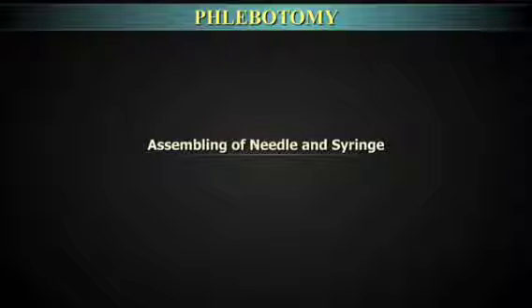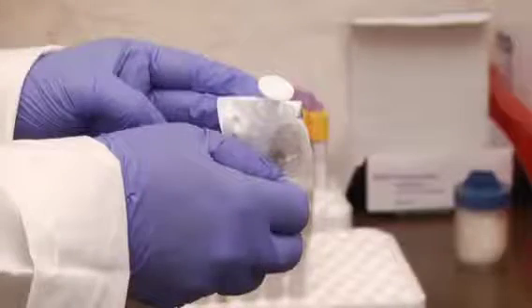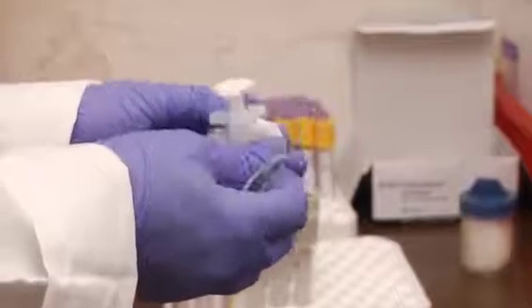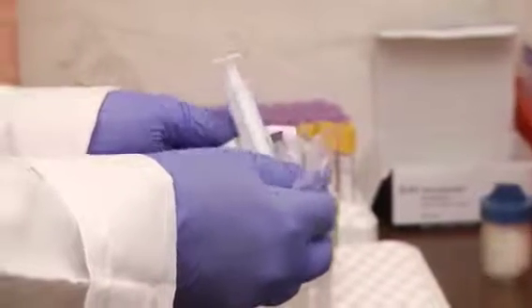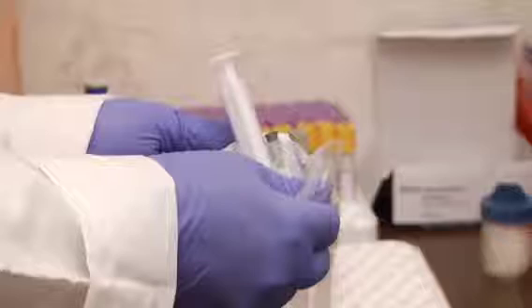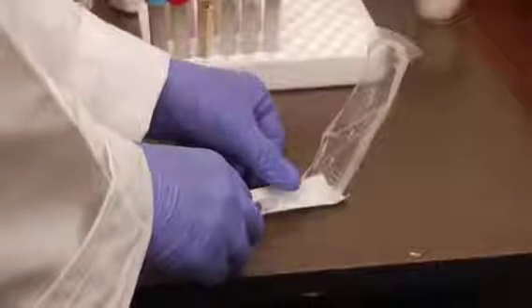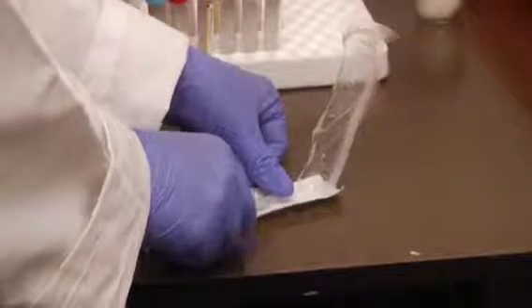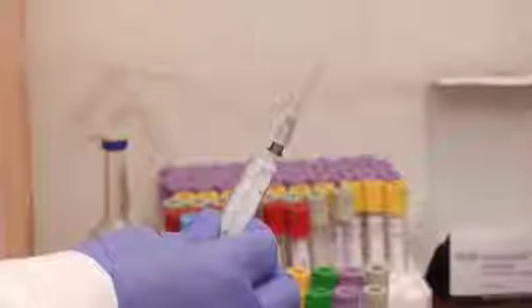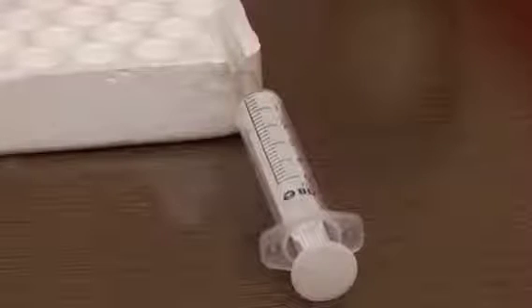Assembling of needle and syringe involves opening the packaging of the hypodermic needle, that is, the back of the needle, keeping it capped. Open the sterile packaging of the syringe from the plunger end, that is, back of the syringe, keeping the nozzle protected in the packaging. Carefully remove the syringe from the package and insert the nozzle of the syringe firmly into the exposed hub of the capped hypodermic needle. Leave the needle and syringe in place until ready for use.